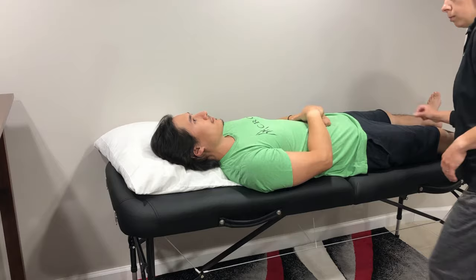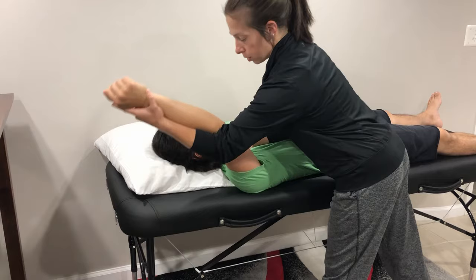Measuring flexion of the shoulder joint, checking passive range of motion first, stabilizing using my arm on the thorax.